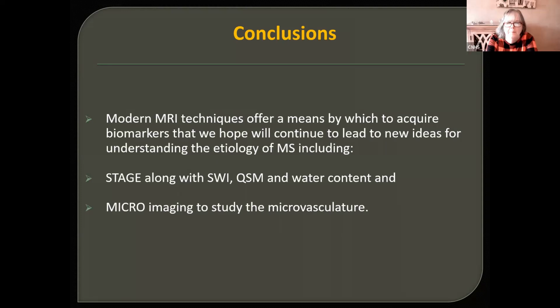Okay. Can flow be measured using micro on vessels in the 500 micron to 3 millimeter diameter range? Well, I am so glad somebody asked that question because I didn't show that today. So you might ask, how are we ever going to show that there's abnormal flow, say, in the ependymal vein, which probably is 2 to 3 millimeters across?